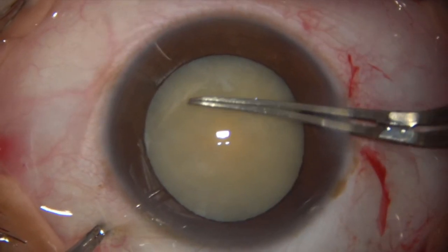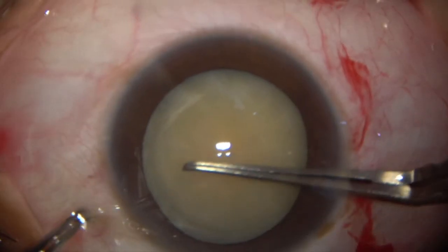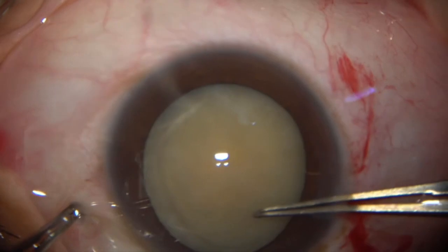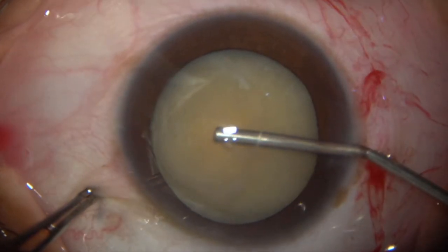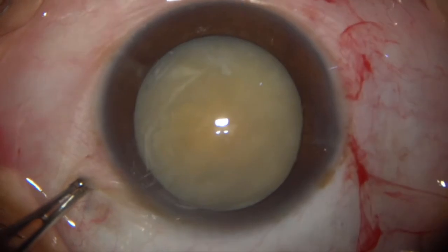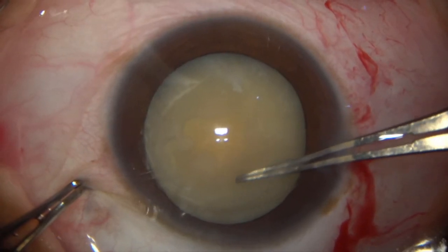The key to managing capsulorhexis in intumescent cataract is to keep a balance of pressure gradient and to raise a flap in the capsule and leave it everted to allow the egress of liquefied cortex from the capsular bag and out of the anterior chamber, just like you would hold a door and prevent it from opening up, the force being raised intralenticular pressure.